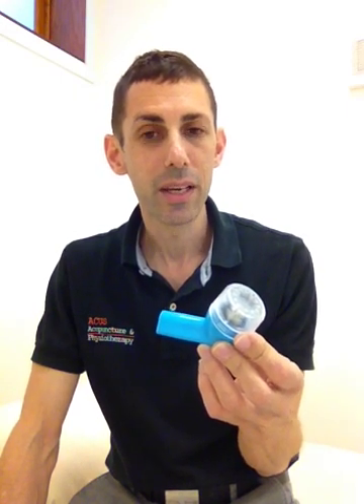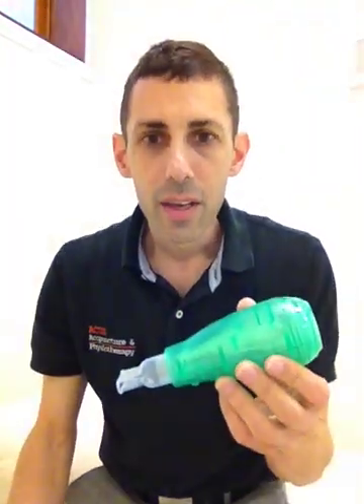One of them being the acapella. The acapella is a very good thing for children that just can't quite get the technique right and hence aren't doing the right practices at home or on their own. So the acapella — I have one here — and the great thing about it is that you can get that positive expiratory pressure without actually setting yourself very upright.